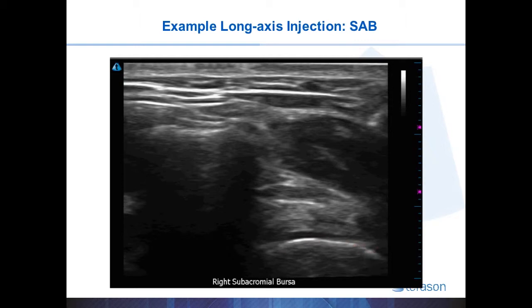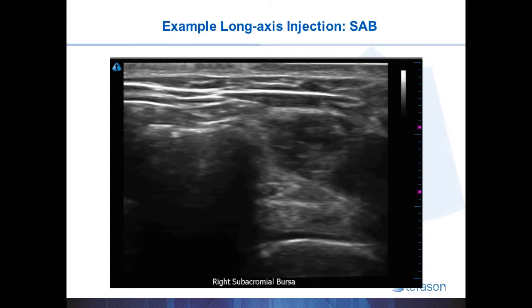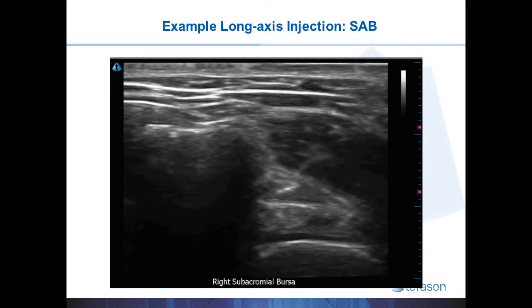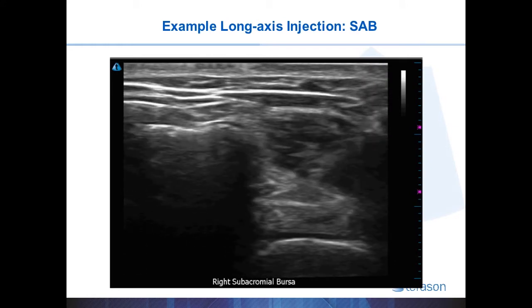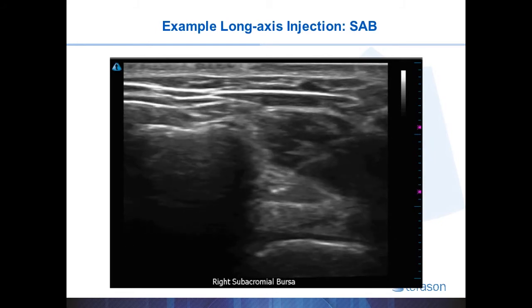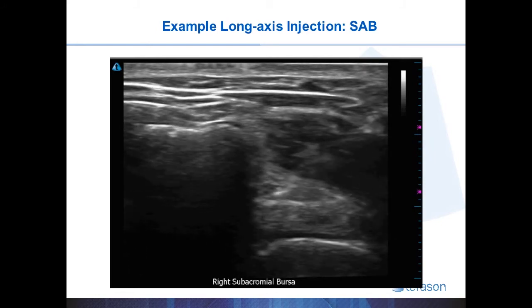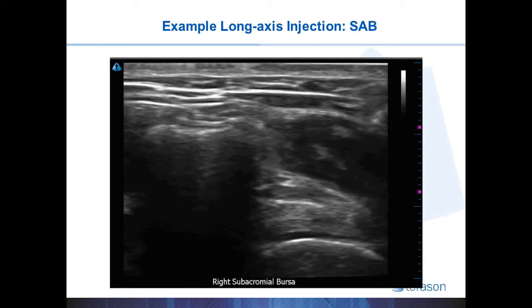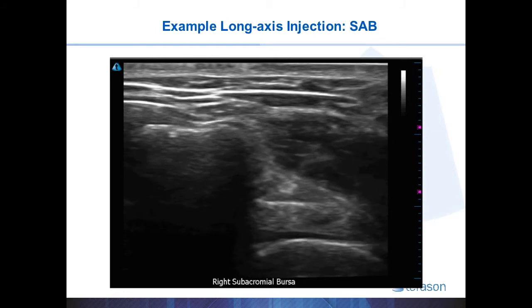The injection will come from the upper right hand corner and down to the left. At this point the injection angle is 50 or 60 degrees, which is relatively steep, and so the needle is difficult to see. You can certainly make out the soft tissues that are adjacent to the needle as they move as the needle passes through them. This will help you identify the needle when you're doing a deeper procedure.